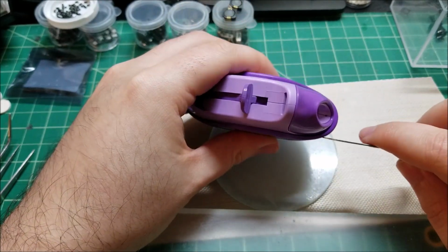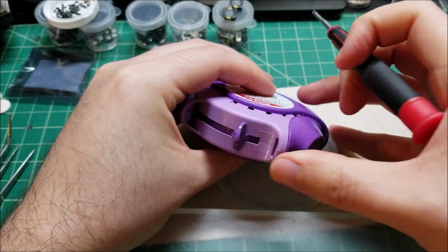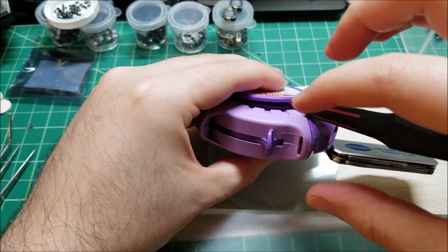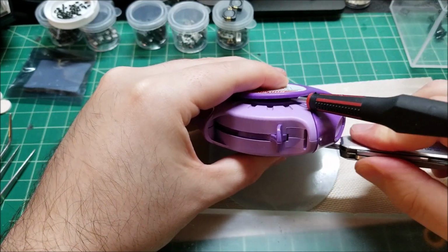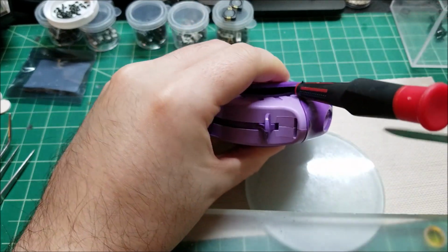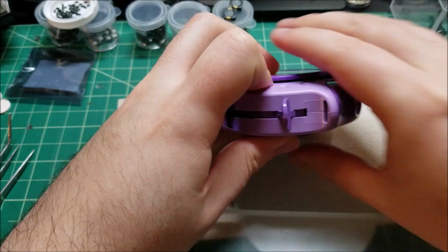It's probably easiest to open this all the way so that you get this gap in here, and then you can get 1 blade in, and then from the other side you can get in those notches. The purpose is there are 2 pegs that go into holes in this outer shell, and you want to get behind those and lever it up. This is going to take a little bit, so I might do this off camera just so I don't slip. Oh, nope, there we go. It popped right out.